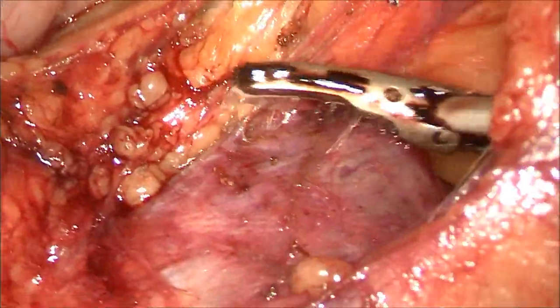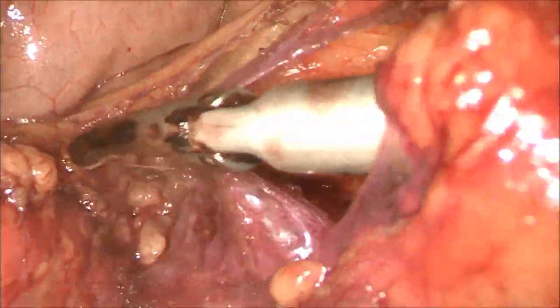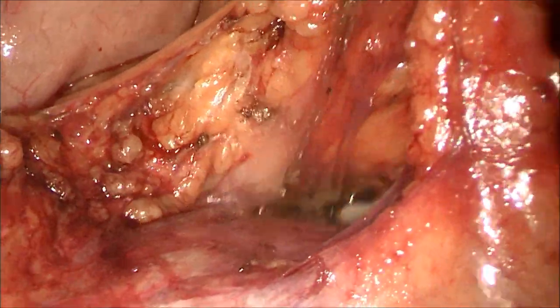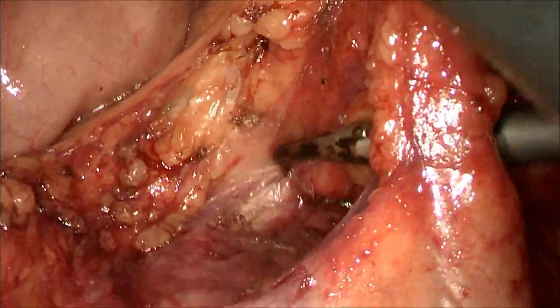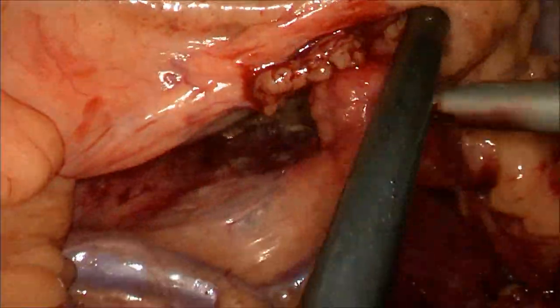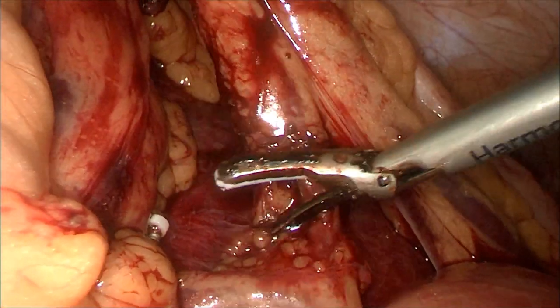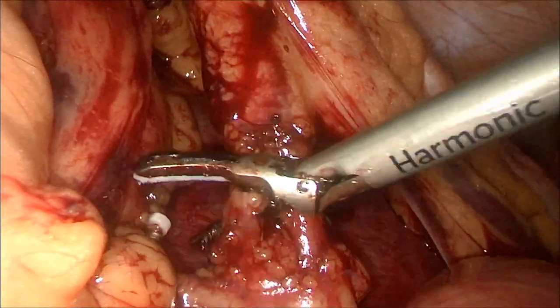Now, the left colic vessels are cleared of the peritoneum and the fibrofatty tissue, and doubly clipped and divided at the origin.